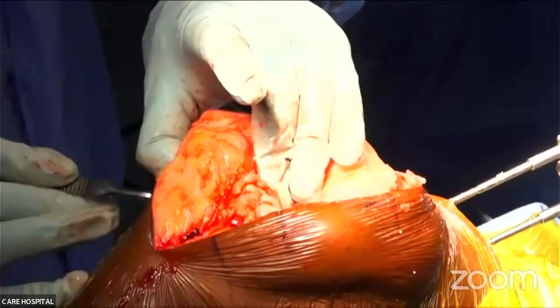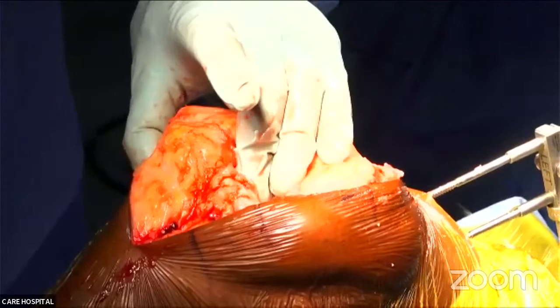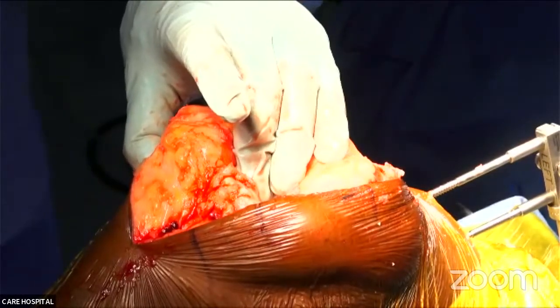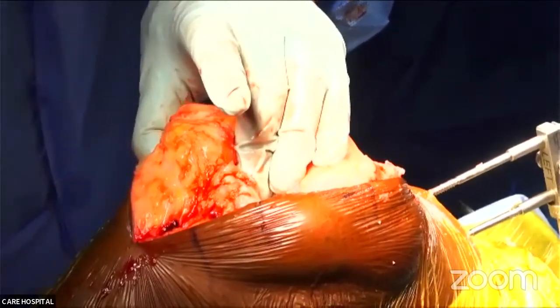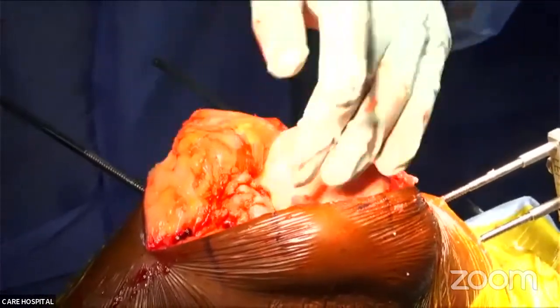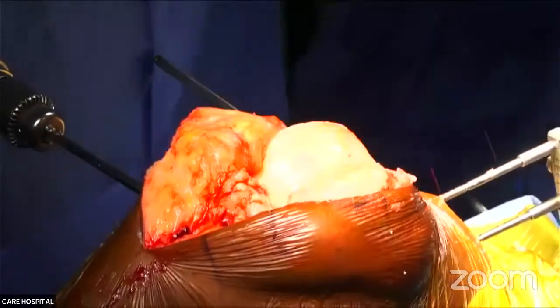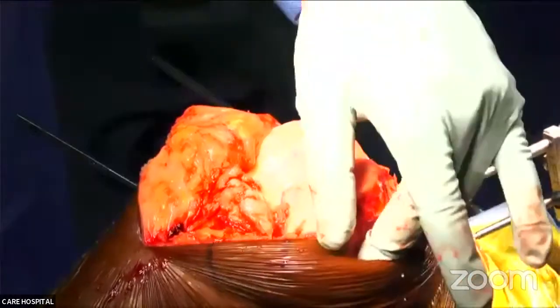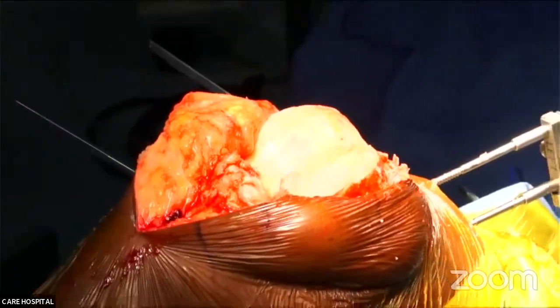Another point which is different from navigation is that we have to fix the patient's limb with the robotic arm. Another very important aspect is that we have to fix the femur and tibia with the robotic arm. So this is what he is doing now. Small pins for retraction. Now we have to fix the femur and tibia with the robotic arm. So this step is different from navigation.